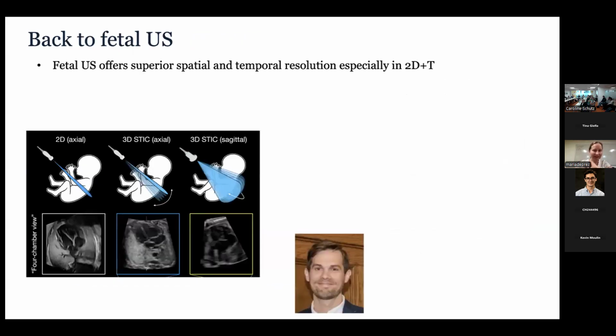And for the final minute of your time, I talk a lot about cardiac, how hard it is to get good resolution. And I showed you at the beginning, ultrasound not so good. Well, not exactly the case for fetal cardiac, because here, this is the lovely GE scan. I don't have a movie, but look at this resolution. And this is 3D STIC, which is state-of-the-art of 3D ultrasound. So when you are in plane, you get not as good as here, but relatively good resolution. But when you are through plane, you get a mess.